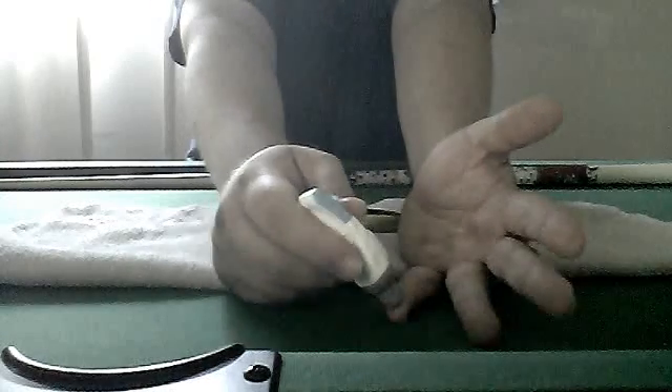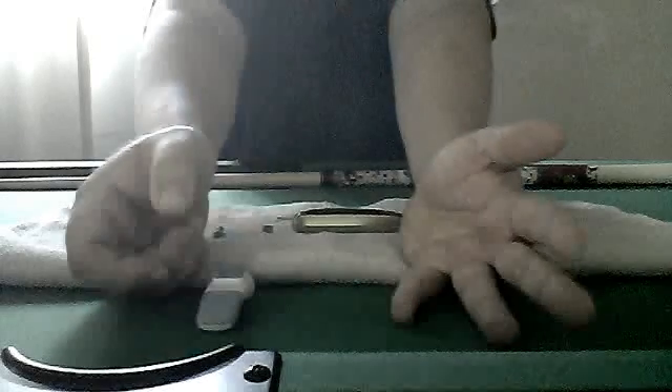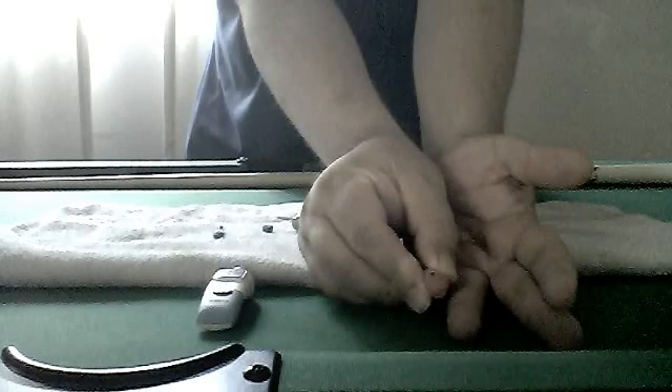Alright, so let's draw the blood. I'm going to get this and stab my little pinky right there. Alright, here we go. Let me squeeze a little bit — and there's some blood.